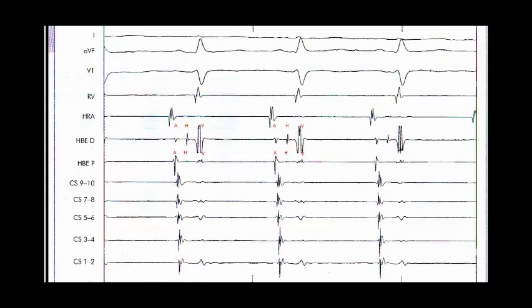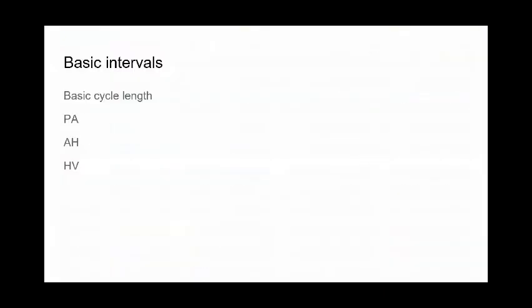What follows is an example of our basic study or diagnostic study in cases of supraventricular tachycardia. Most commonly, we do supraventricular cases. So you have a patient with documented supraventricular tachycardia, and this patient has it mostly paroxysmally, it comes and goes. It responds to either drugs or DC shock, and it's repeated maybe for a long time, or a long history for the patient. And now I go with this patient to the lab to do a study and to detect the type of tachycardia and then determine the ablation target that I am targeting.